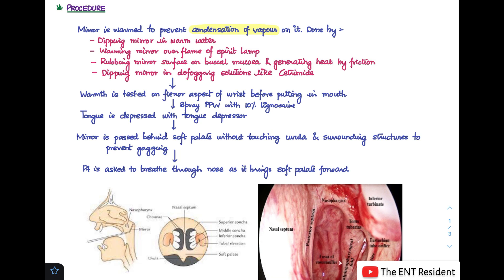Once you are sure that the mirror has been warmed, test that warmth on the flexor aspect of your wrist before putting it in the patient's mouth. Once your mirror is ready, spray the posterior pharyngeal wall of the patient with 10% lignocaine spray so as to prevent the gag reflex, and give it two minutes to act.